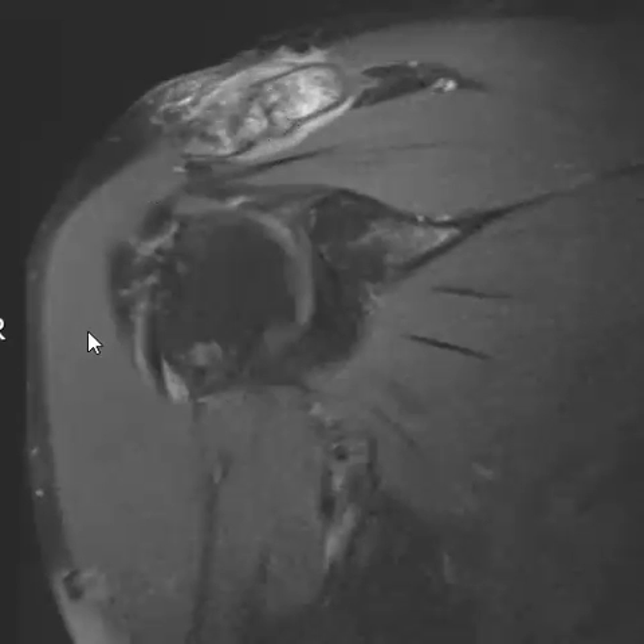We see this really prominent erosive change and intense marrow edema with a lack of other findings. Usually this is AC osteolysis, which just means the bone is getting worn down faster than it can repair itself. There's chronic repetitive motion at the AC joint — lots of times these are powerlifters or weightlifters with chronic repetitive stress. Other times they can do overhead lifting activities and get this.